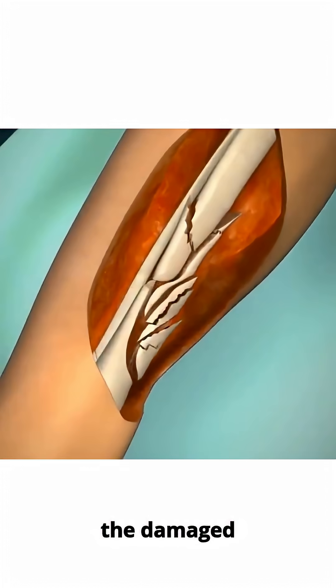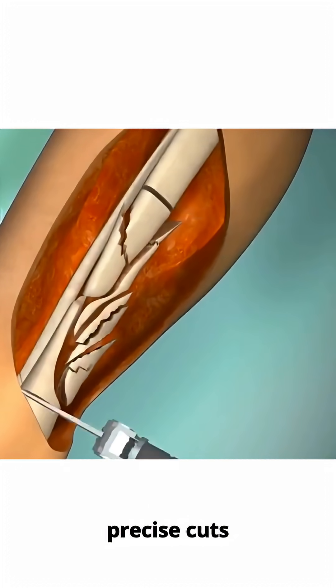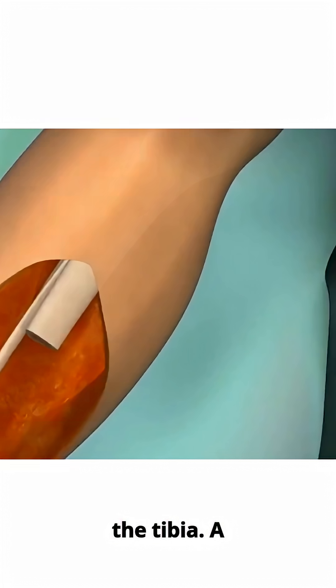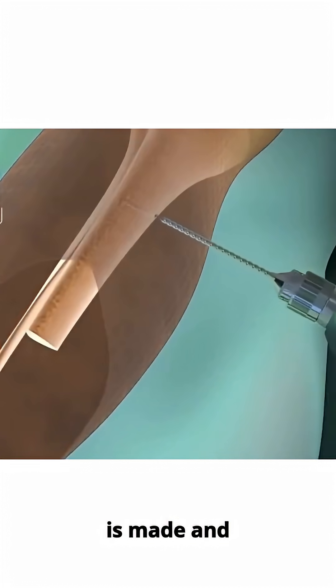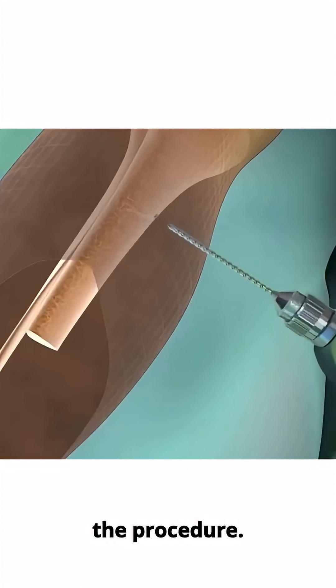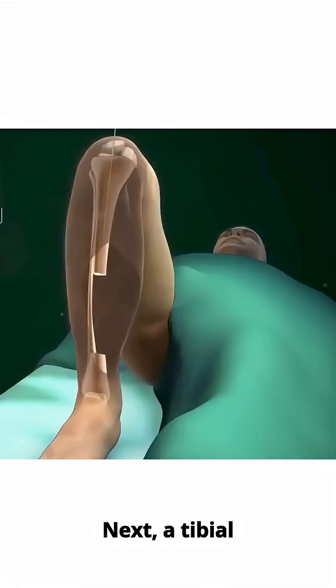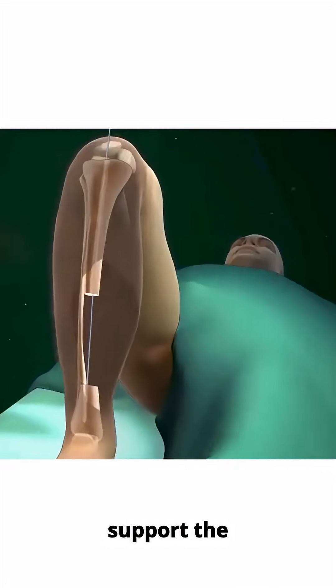To treat a bone injury, the damaged bone is removed and precise cuts are made in the tibia. A small incision is made and holes are drilled to prepare for the procedure. Next, a tibial rod or nail is inserted into the bone to support the transport.